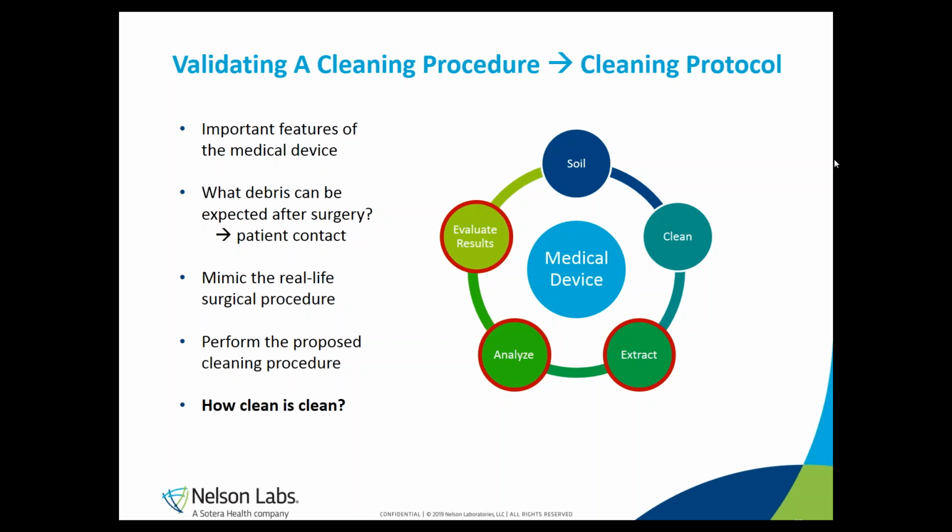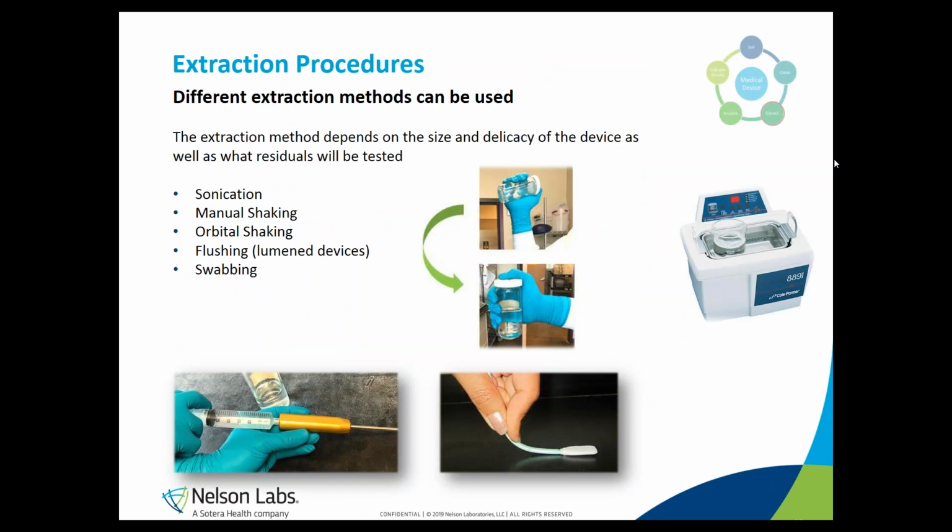After designing and performing a cleaning protocol, we want to make sure, of course, that the device is indeed sufficiently cleaned. Therefore, we have some analytical techniques in place to quantify possible remains of the test soil after performing the procedure. To be able to quantify any residues of your soil, the clean device will be extracted. Different extraction methods can be used during the validation of a cleaning procedure to collect the remains of the soil in an appropriate extraction volume.